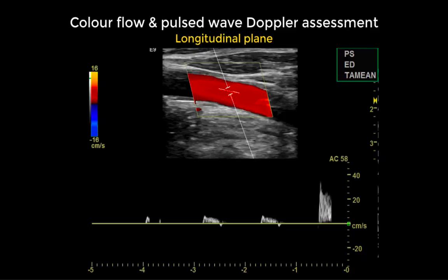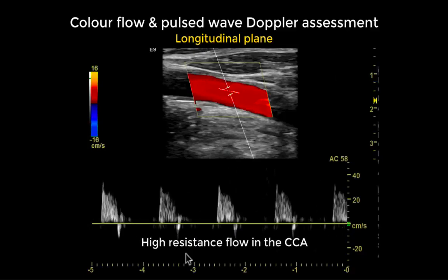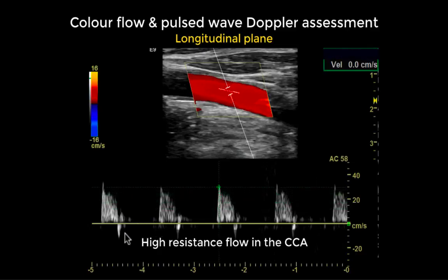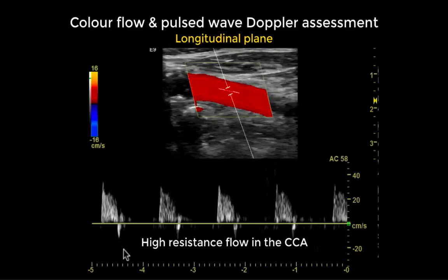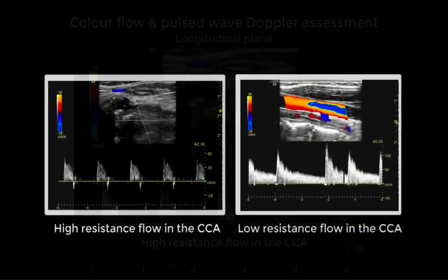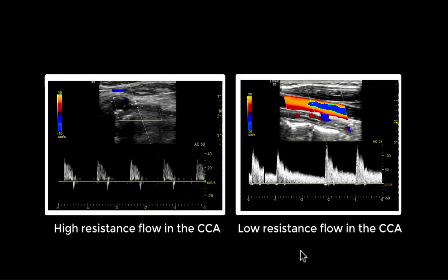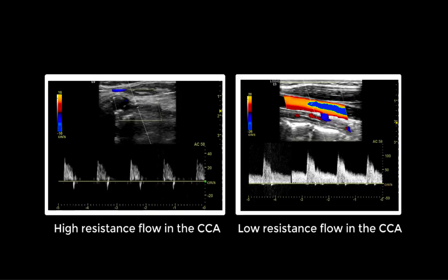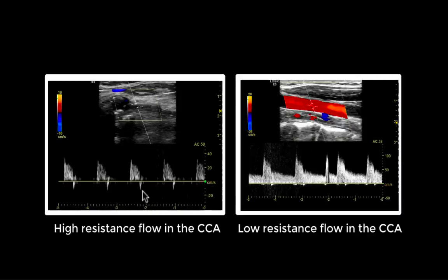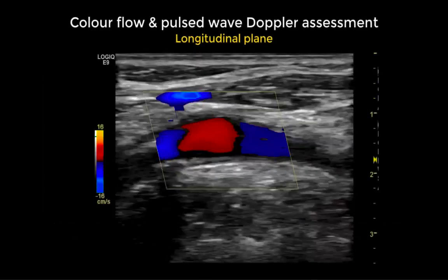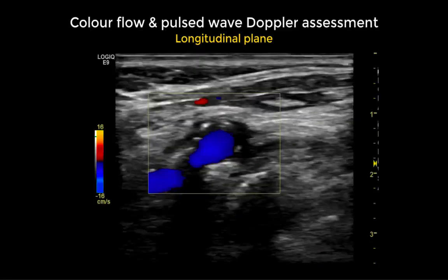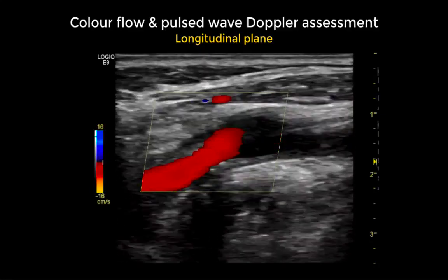With pulse wave Doppler we obtain a waveform which is quite unusual for a common carotid artery. This waveform has high resistance with no diastolic flow pattern, showing a small reversal flow in delayed systole. The normal common carotid waveform is low resistance with well-represented diastolic flow; the absence of diastolic flow is indicative of distal high resistance likely caused by obstructive disease.